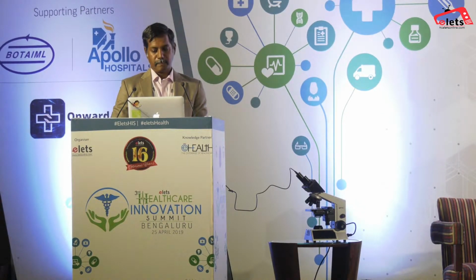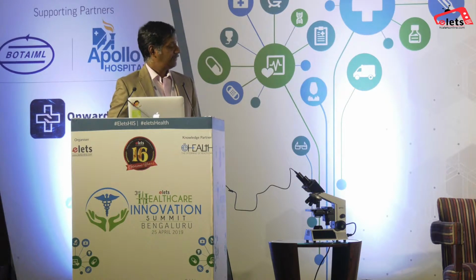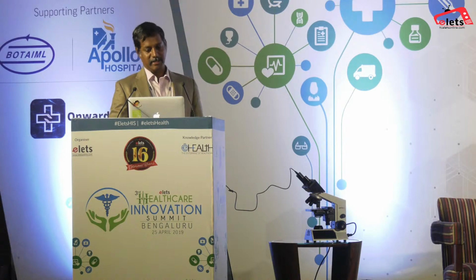Primarily the technician will be able to log in, enter additional slides, if you have images here, or you can actually go to a live capture of the slide. Here we have a smear which is kept under the objective, as soon as that slide comes up.